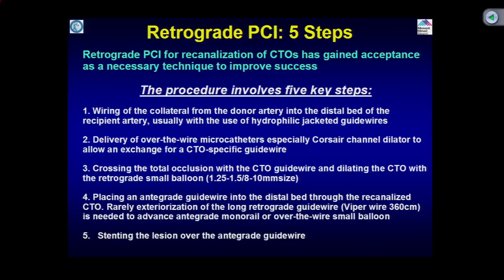Now the question comes, what should be the CTO guide wire? If you cannot get through the septals with your usual floppy wires, I would give 3 wire choices. They usually are the glide coated floppy tipped wire.